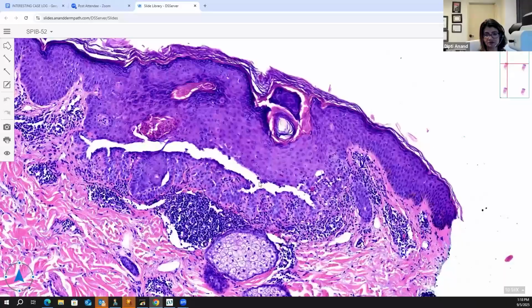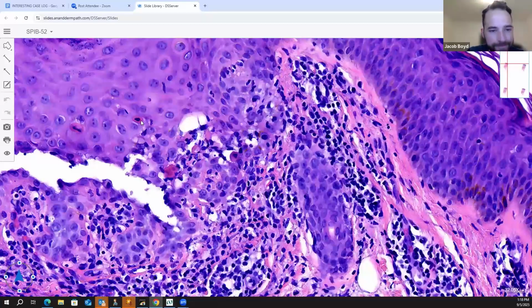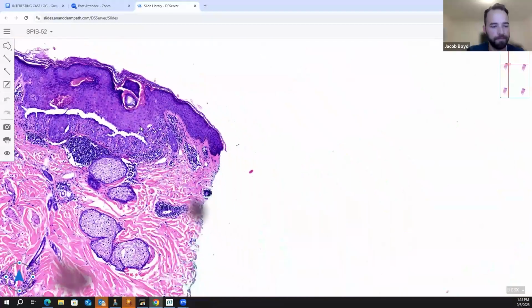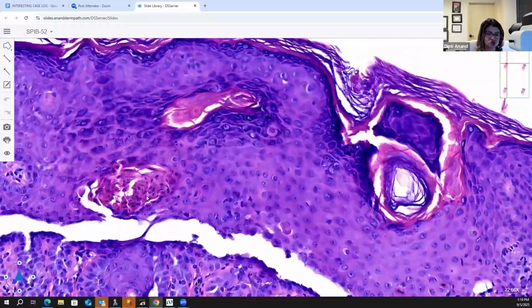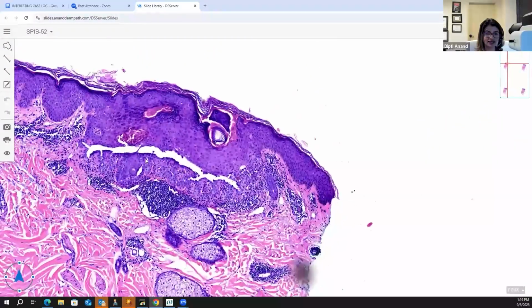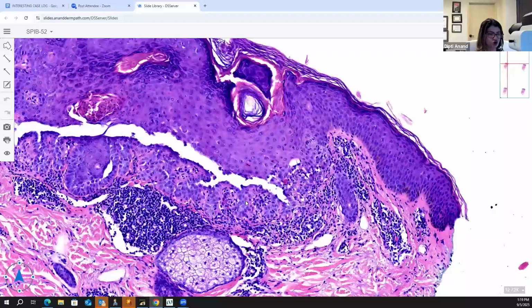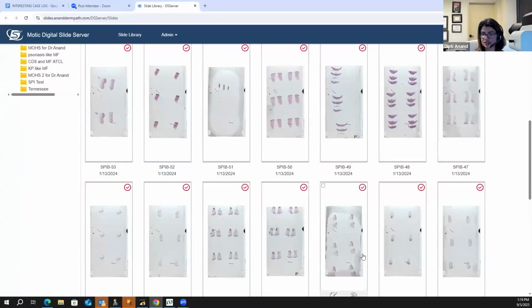Okay, and then Jacob, do you notice those necrotics here again? Yeah, I can see them. Yeah. So it's not that they're not there in Darier's disease, they are there, but in that case, because it was so confluent, it became just prominent. So in every acantholytic dyskeratotic process, you will see the individual necrotics. It's just that your eyes catch those up because those look more prominent. But you see again here, the DE junction is normal. So they are in the upper layers. Okay, the next one is 50.